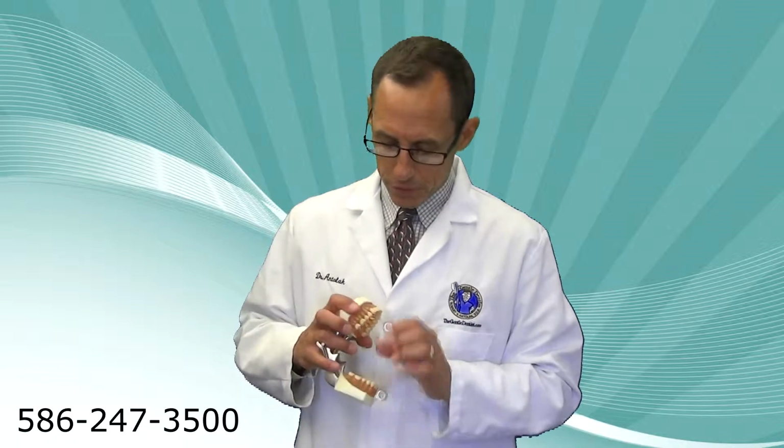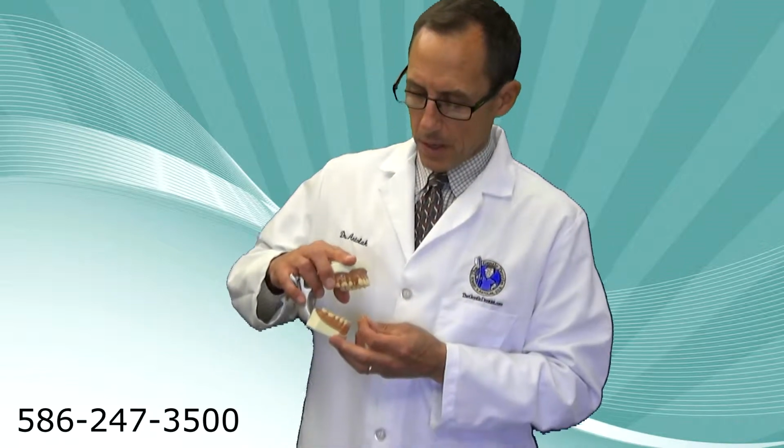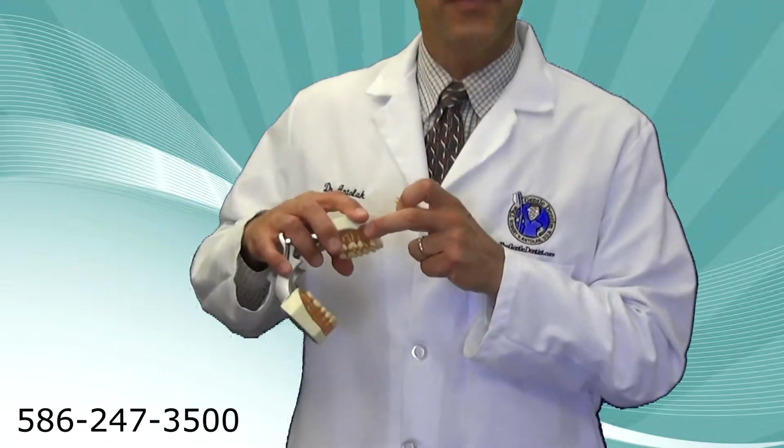One thing that we do at our office is we place dental implants. We not only do cosmetic dentistry, but we want to do some things to replace teeth. Dental implants are, for example, if a tooth is missing, and in this example it'll show a tooth that's missing, what we want to do is to put something in there.